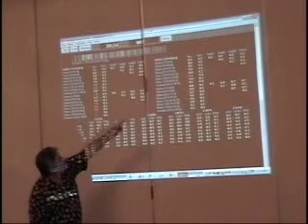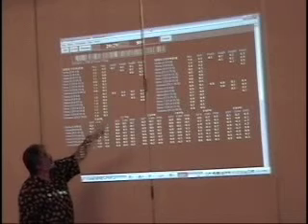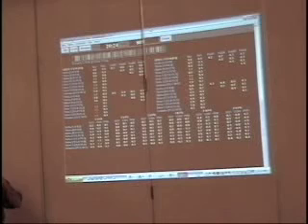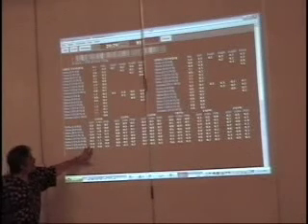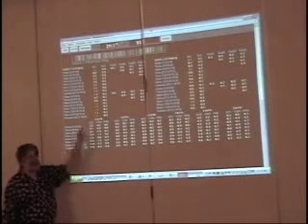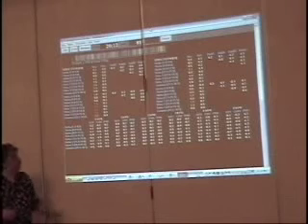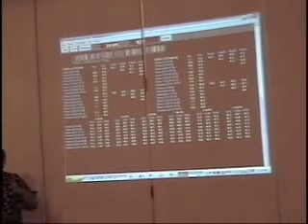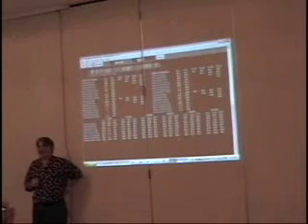We do see a little bit here, P3 and P4, what's indicating as a little bit high beta, 15 to 18, we're like 1.2 standard deviations. It's not very significant. This is really where the findings are. And it's when these qualities are moving more toward normal on an instantaneous basis, that's when the feedback is coming. So it's guiding her and telling her when these guys tend to be more in the middle of the road, that's when the animations and sounds are coming.